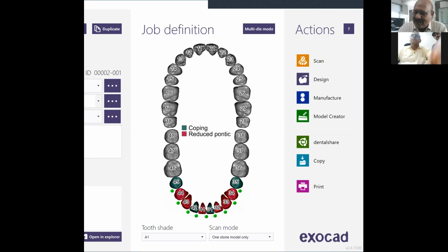So only milled objects are successful and good enough, and then you can use the company's tools. Why do you think companies spend a lot of money in fabricating their titanium screws? Because they understand the material property, the structure, the surface very well. They have studied it so much, they have researched it. So we cannot belittle the company's efforts of research and development. So we should follow the protocol. Otherwise, this printing, though it is a shortcut, is going to create a lot of problems. What if implants also get damaged?